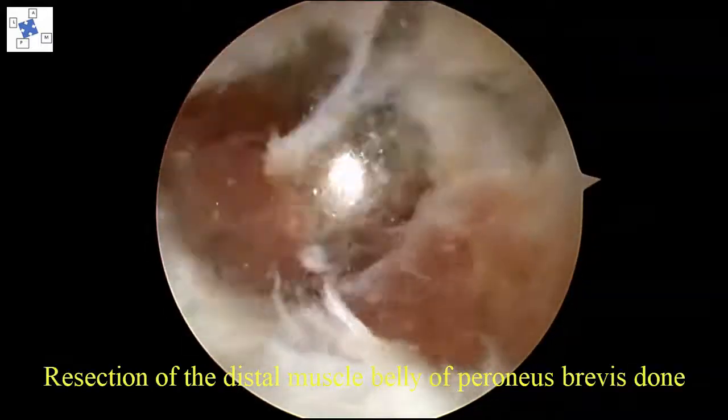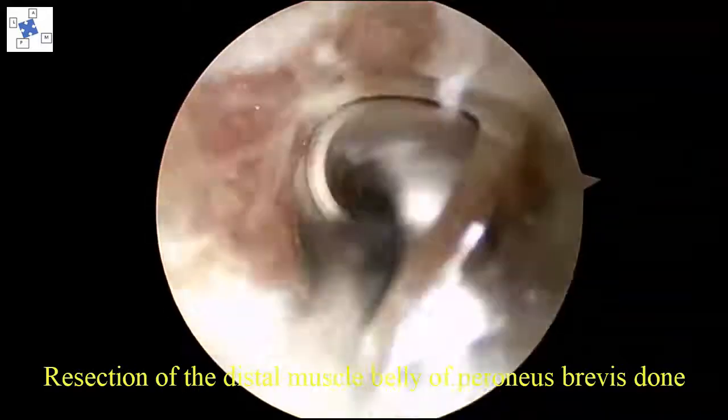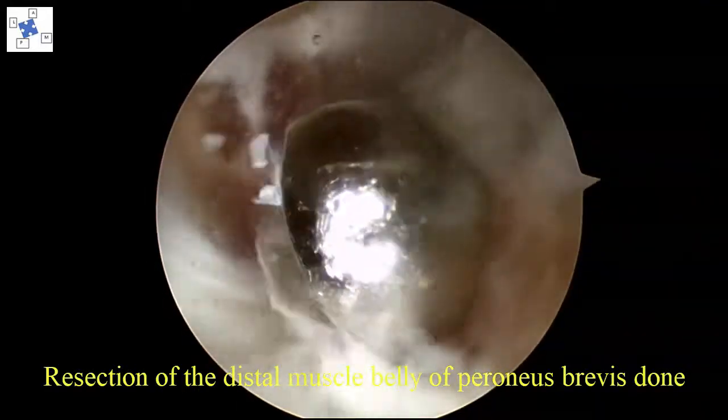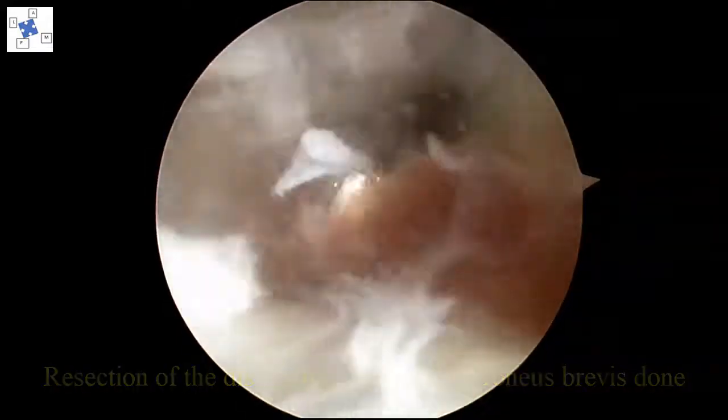Here the low-lying peroneus brevis muscle is being resected. The low-lying peroneus brevis muscle is an anomalous extension into and distal to the retromalleolar groove, which causes crowding of the groove and is a precursor of tendon irritation, tenosynovitis, and tendon instability including subluxation and dislocation. Some surgeons recommend elective resection of a low-lying peroneus brevis muscle in the groove, which will allow better gliding ability of the tendons as they course around the ankle.